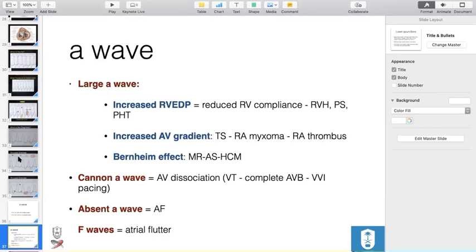Dr. Reem, yes, you're right about the mechanism. It's purely a diastolic event, right? We said the A wave is a diastolic event. So what happens in mitral regurgitation? You have a volume overload, and that's where the LV gets dilated, and that's going to push the interventricular septum, as you said, during diastole. And when the right atrium tries to squeeze, to do the atrial kick against a smaller cavity because it's getting pushed by the left ventricle, it's better visualized. The same thing for aortic stenosis.